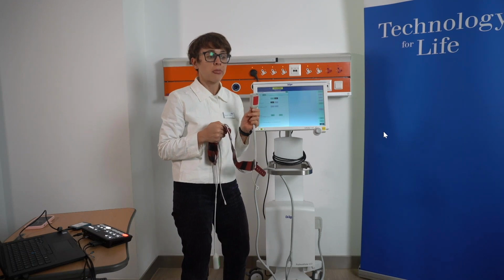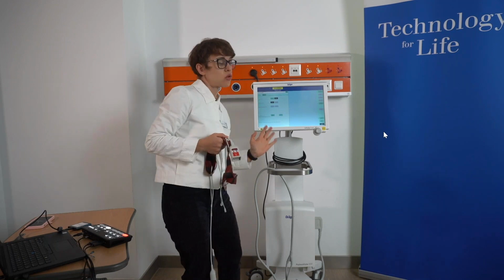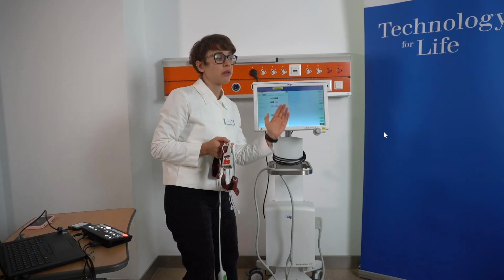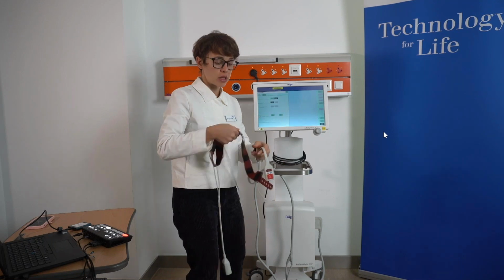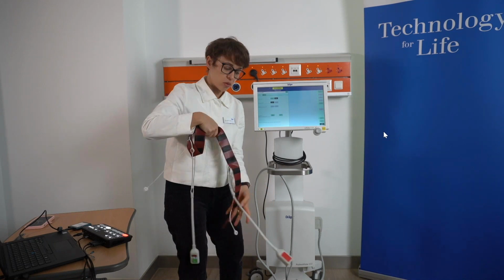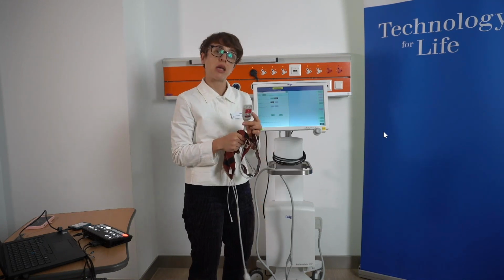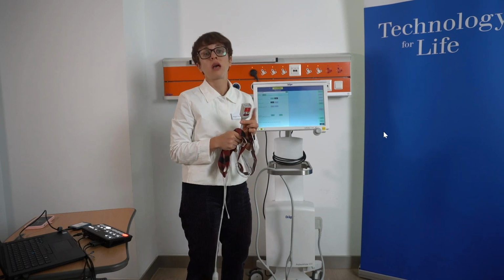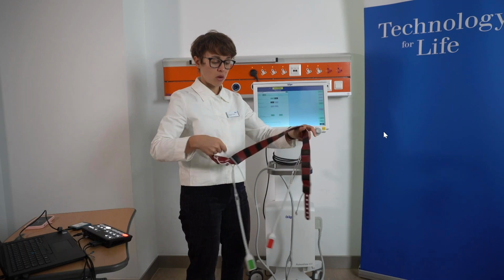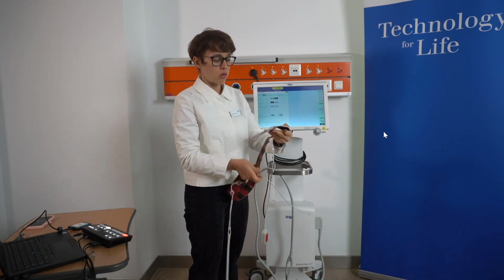So whenever I do the measurements in the ICU, if it's possible to lift the patient, I would rather slightly lift the patient and slide the belt back, because the challenging part is to slide in the electrode extensions. So basically you position it on the patient, then make sure that you close the belts.